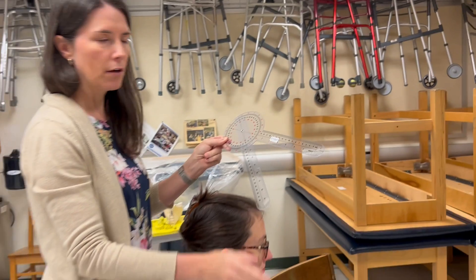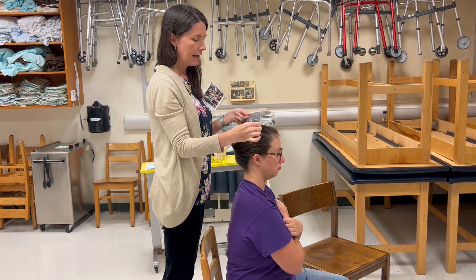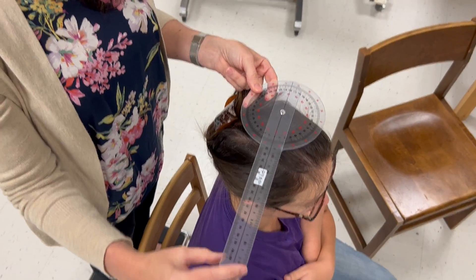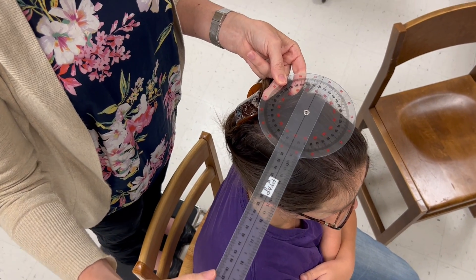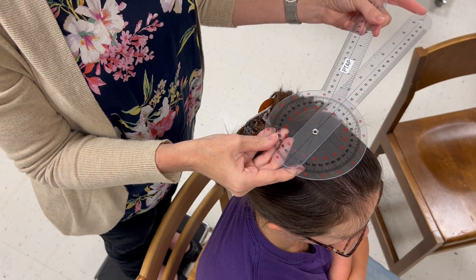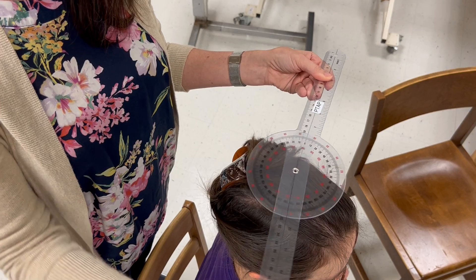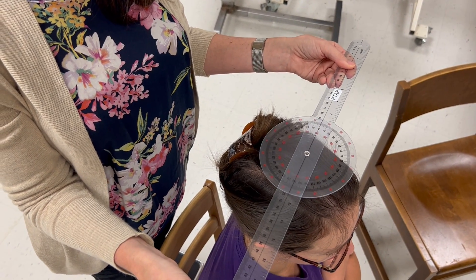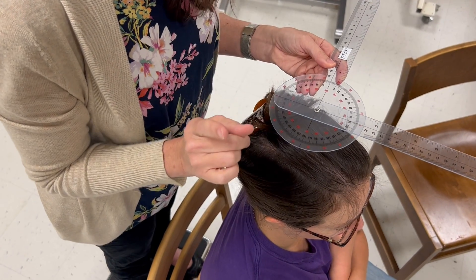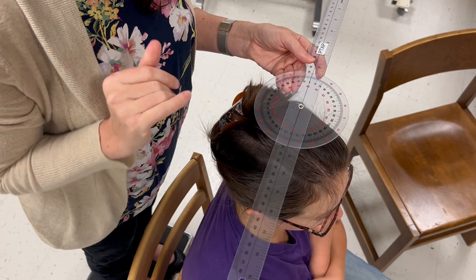When it comes to setting up your goniometer there are multiple ways to do this. You can hold it so that both the stationary arm and the moving arm are over the patient, or start it in different orientations for right and left rotation. There are lots of different ways — whichever works for you is fine. Just don't get confused: students often mix this up with the cervical rotation starting position, but we're only looking at the trunk, so make sure that doesn't confuse you.